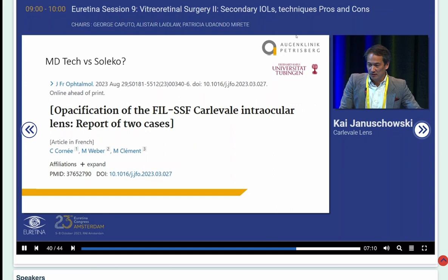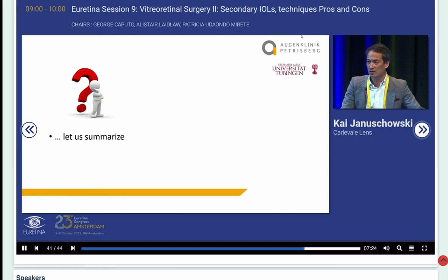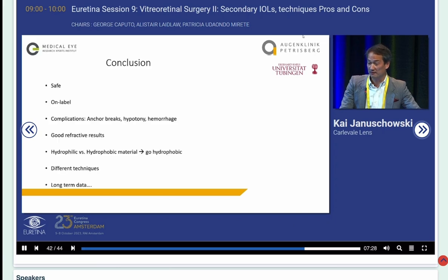And a very, very actual case report came out. I have been talking about that quite a lot, that you shouldn't be using the hydrophilic one, and now the first case report came out with the opacification of the hydrophilic one. So just don't use it. Use the hydrophobic ones. We are VR surgeons, and we should be very aware of that fact.